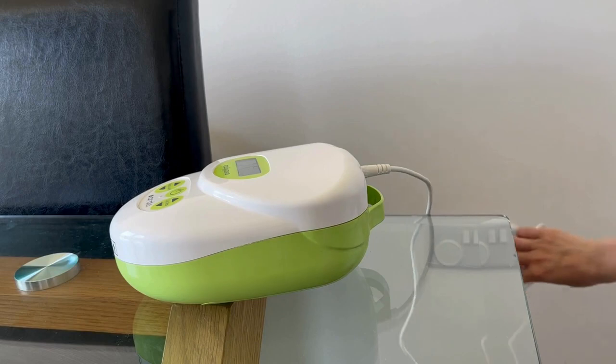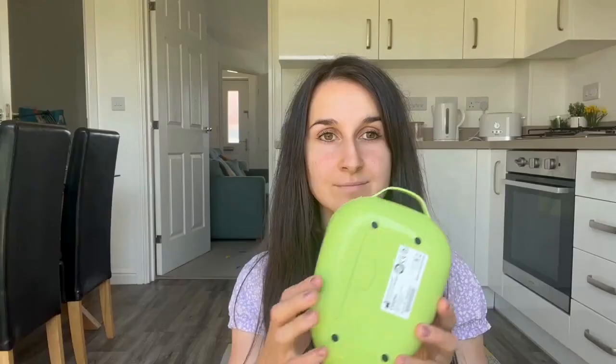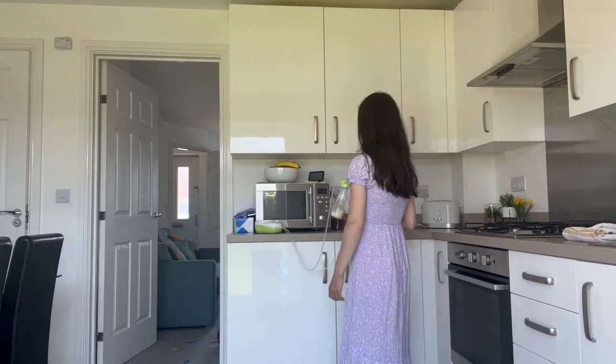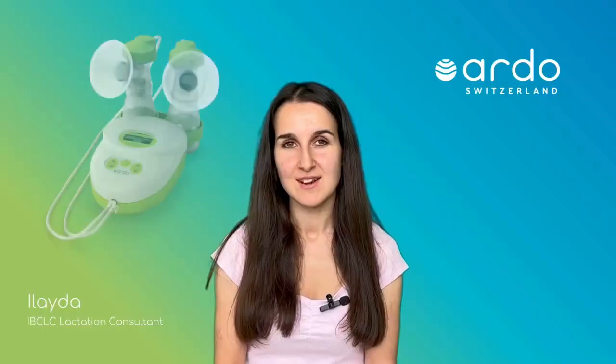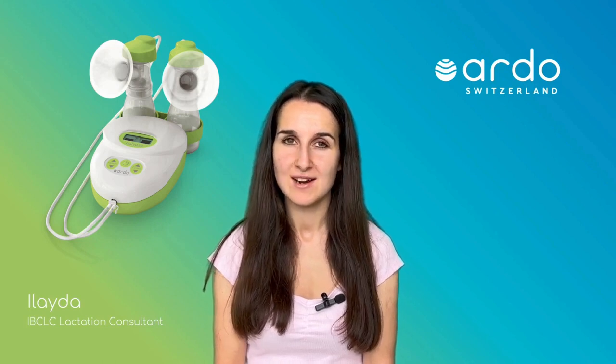There is a connection point for the cable in the back of the pump which can be plugged into a plug socket. Make sure to use the cable provided by Ardo and not any other cables that look similar. There is also the option to use batteries on the underside of the pump — you need six AA batteries, good quality and not rechargeable. When you're not using the pump or you're using the cable to power the pump, remove the batteries. You can get support from Ardo with any troubleshooting issues either online or by phone.